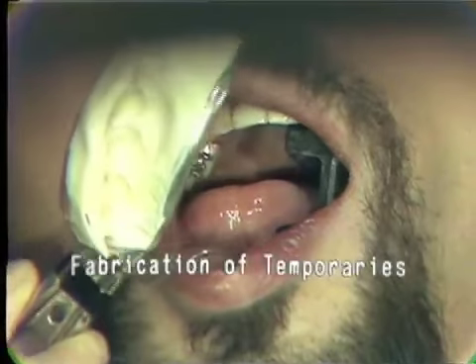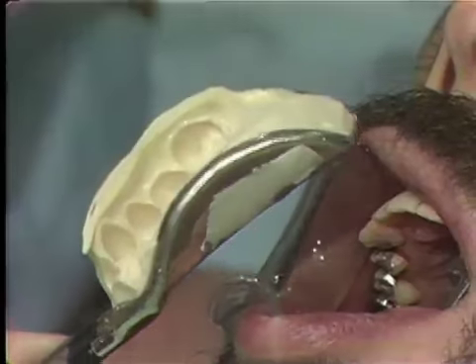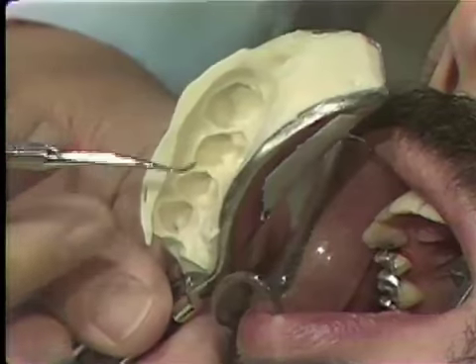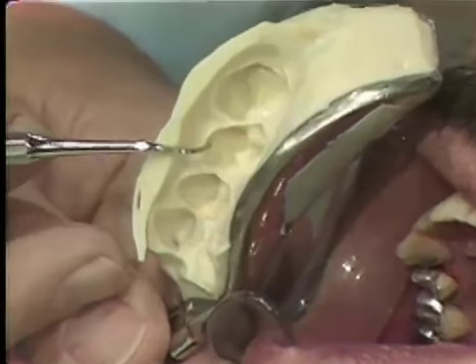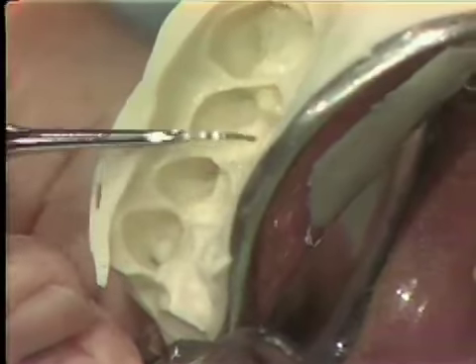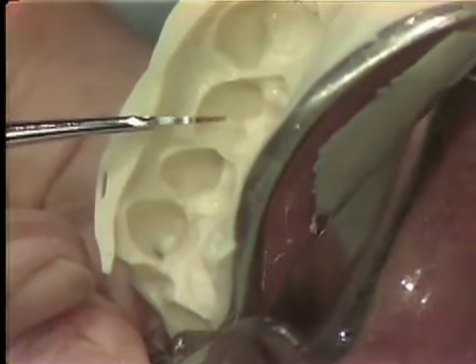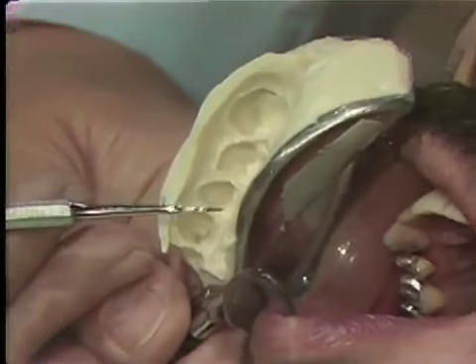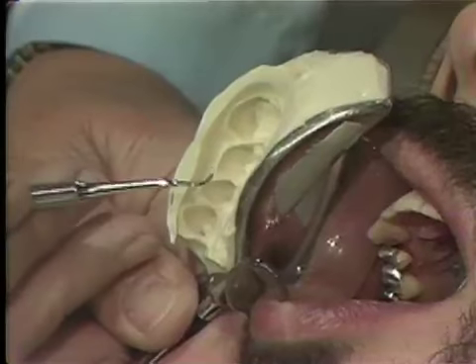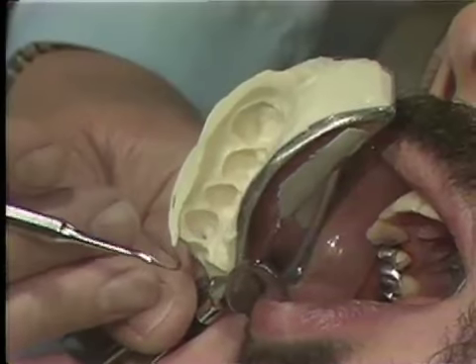However, an alginate material can be used similarly to fabricate multiple temporaries, and this alginate impression can be used in a couple of ways. If you're going to use an alginate impression, you'd want to trim away the gingival area a little bit, and take away any irregularities in the preparation or in the existing teeth that you'd want to correct. Then you could make a thin shell temporary. You would paint Duralay inside of the impression, make a thin shell that you could take out, load up with acrylic material, and put in place in the mouth.